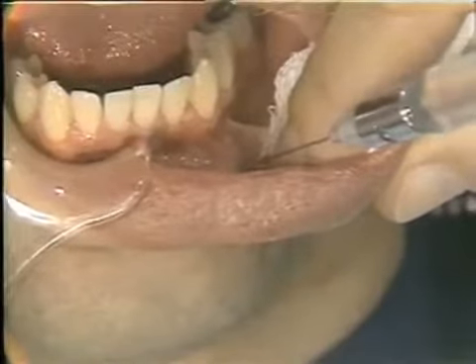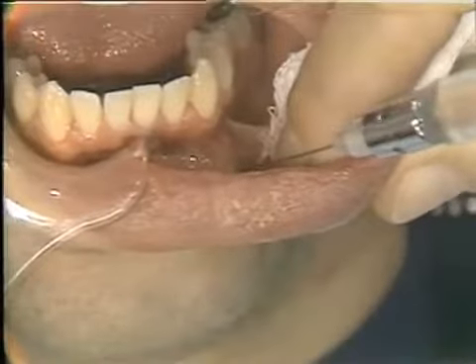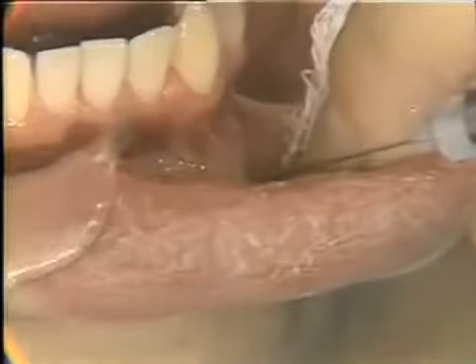I'm going to aspirate a little bit. We get no blood back in the syringe. We know we're in a safe position. And remember again that any time the needle bevel is against bone, you can lean on it a little bit. This will elicit no discomfort whatsoever. And very slowly we'll inject approximately a half cc of solution.